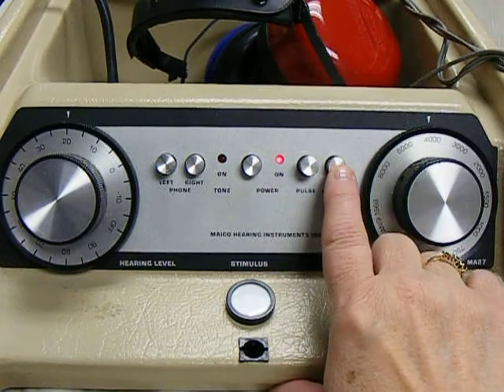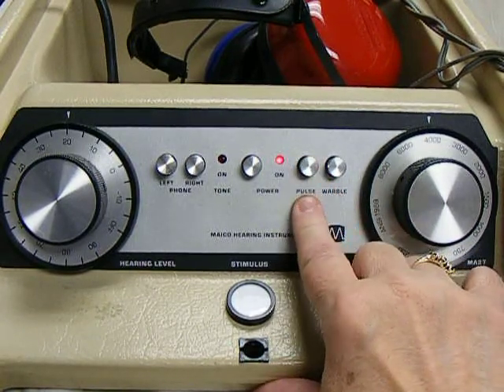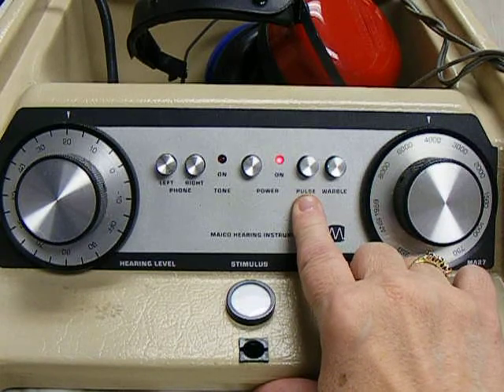These two buttons control the type of tone you're presenting. This button is a pulse tone — beep, beep, beep.